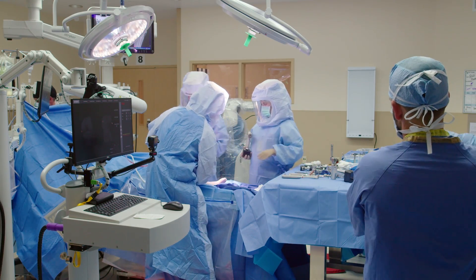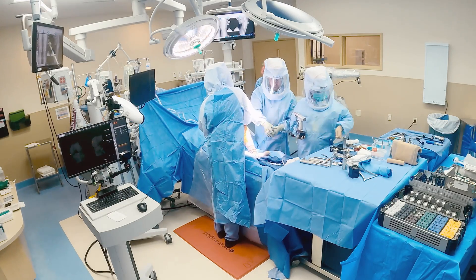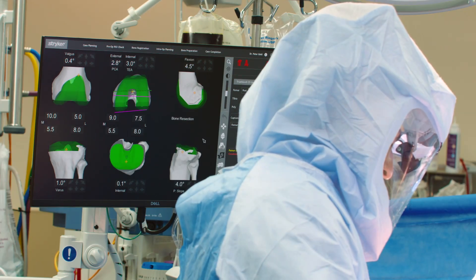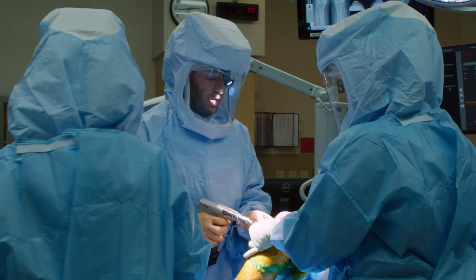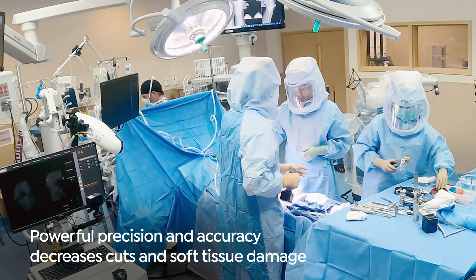At this point we can take the arrays out. That's one of the biggest advantages of doing a MAKO total knee or a robotic total knee — because we do all the planning up front and then we get to execute that plan. You don't have to go back and redo cuts or retry things. The precision and accuracy of what we're doing is really powerful.